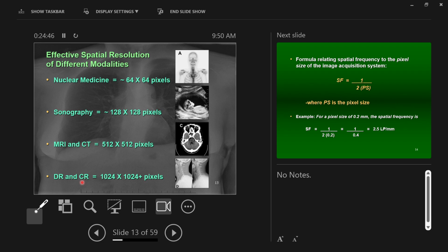Yes. So if digital radiography and computed radiography have better image clarity, why do you have to get an X-ray before you can get an MRI in most cases? So that you can... because MRIs are expensive, even though they have less involved. Yeah, but they're expensive to run, expensive to do the image.